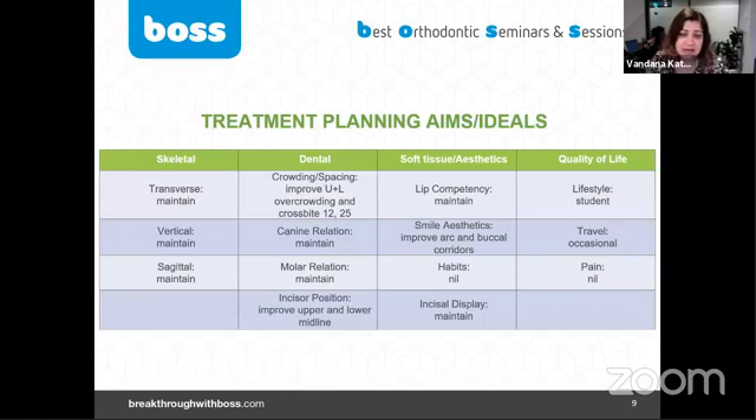Here is our treatment plan: we want to maintain and accept the skeletal balance, correct the crowding and crossbites, maintain molars, canines, and incisor positions — which are already pretty good — maintain incisal display on smiling, just improve that one millimeter midline shift, and slightly improve buccal corridors.